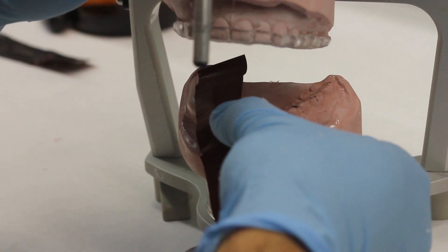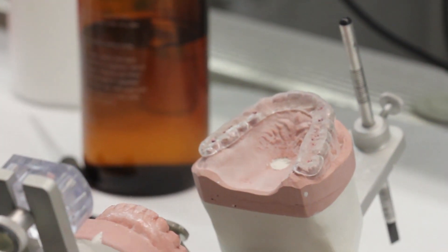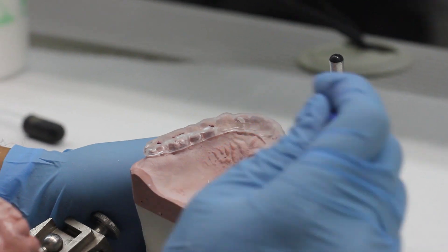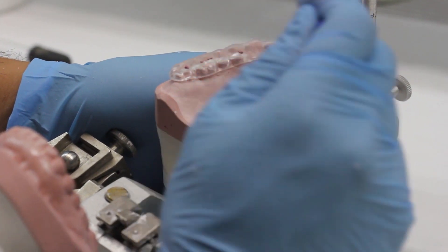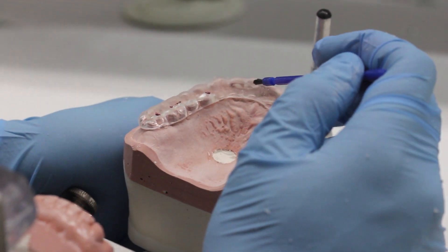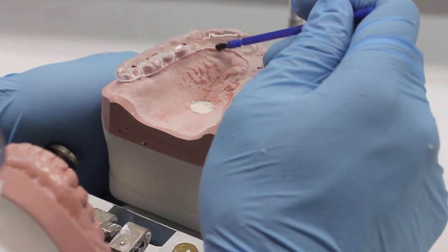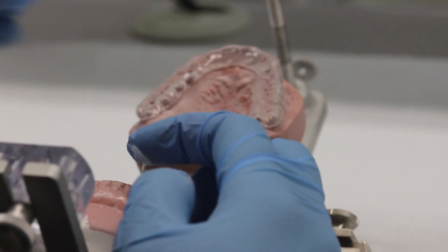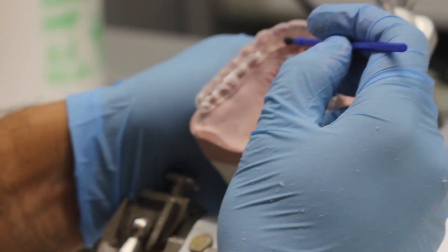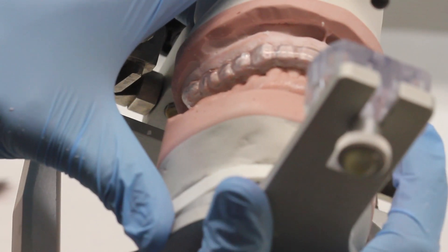Check the occlusion again and verify that you have all the marks — you want to see marks all the way around. In this case we accidentally removed some of the marks in the anterior. In the posterior you can see well-distributed occlusal marks, but in the anterior we ground away just a little bit more acrylic than needed. To fix that, add some orthoacrylic in the contact areas — take a little monomer and powder and sprinkle it onto the lingual surface of the maxillary anterior teeth. Wait until it reaches a slightly doughy stage before closing it down, and paint the opposing teeth with Vaseline so the acrylic doesn't stick to them. Then close the articulator and the acrylic will form against the incisal edges of your mandibular casts.